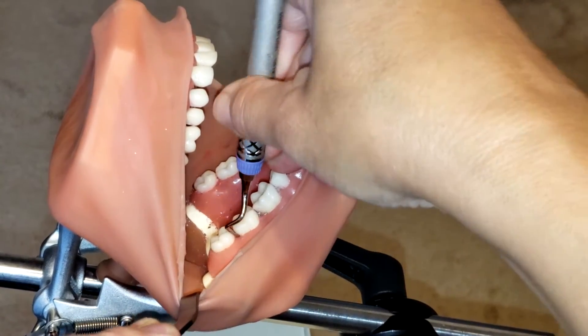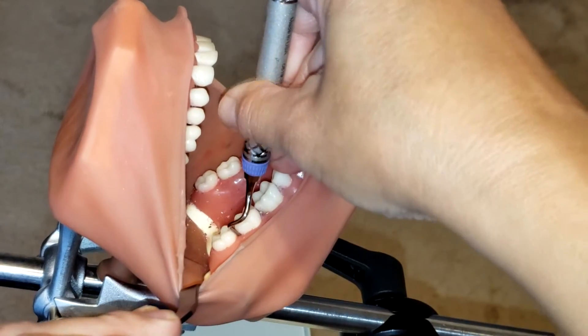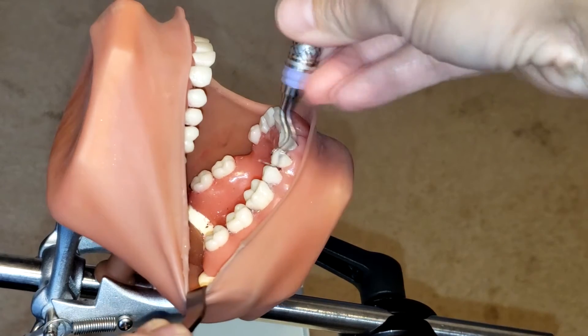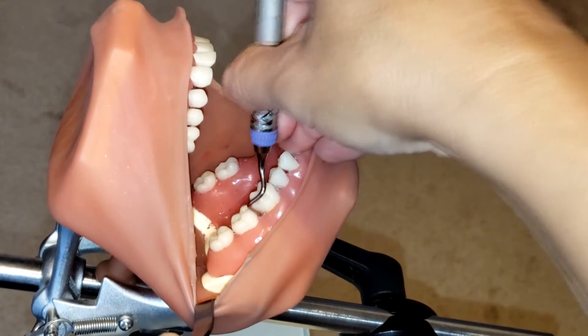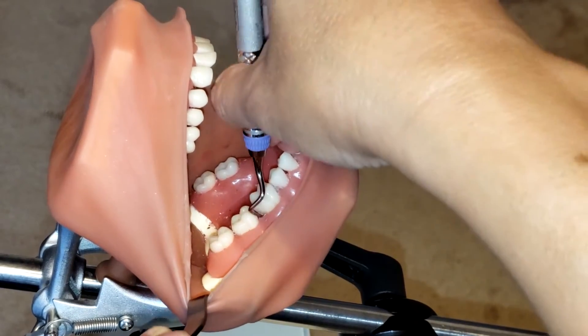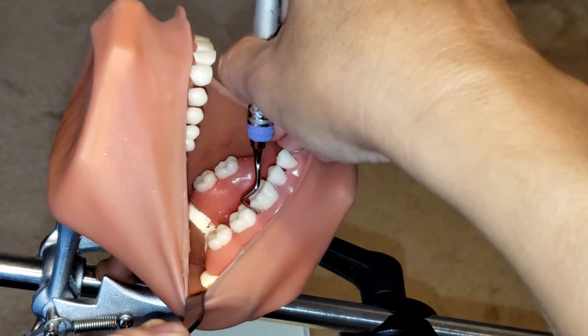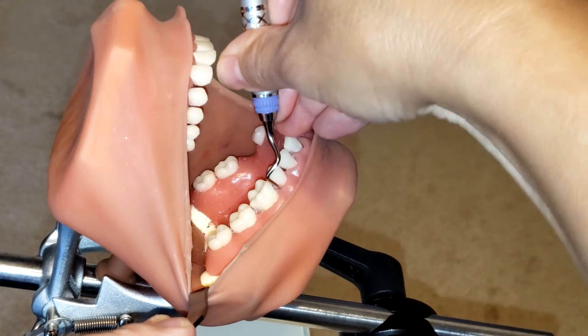Start at the distal line angle, insert nice and smooth, and begin to roll immediately going into that interproximal space, because you need to keep that toe-third fully adapted to the tooth for calculus removal. Insert and make sure also that you keep the lower shank as parallel as possible to the long axis of the tooth as you go in proximally.